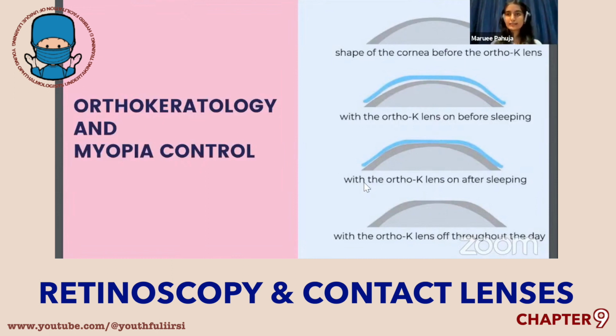What orthokeratology does is that you wear these lenses overnight, sleep with the lenses, get up in the morning, take the lenses out, and throughout the day you do not wear any other form of correction. They temporarily, mind you, temporarily reshape the corneal shape so that the patient is aided with good vision throughout the day. It is a reversible procedure, so that's a really good advantage of orthokeratology lenses. And the way these lenses alter the shape of the cornea, they help in myopia control.